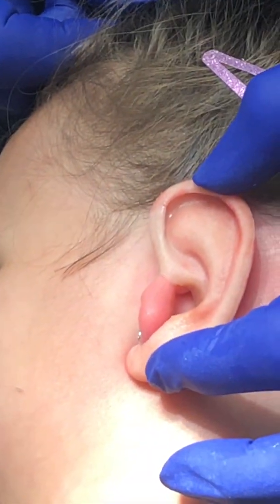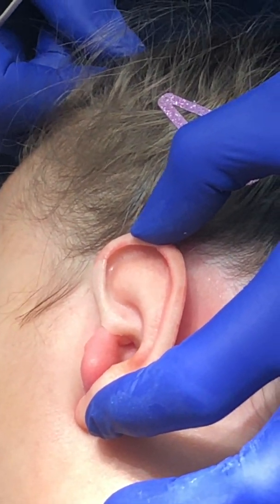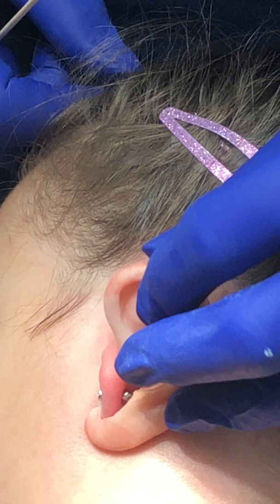You can see the color is very sweet, everything matches, and in this video I'm going to show you how to place the adhesive on the ear.